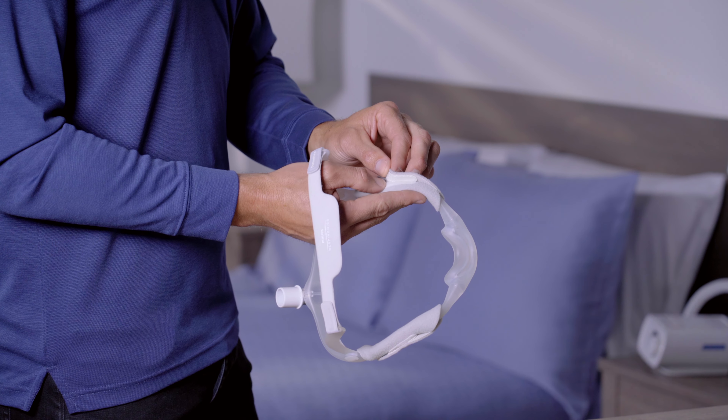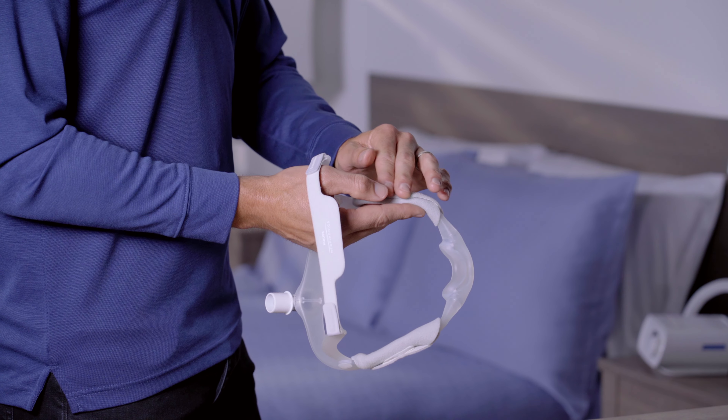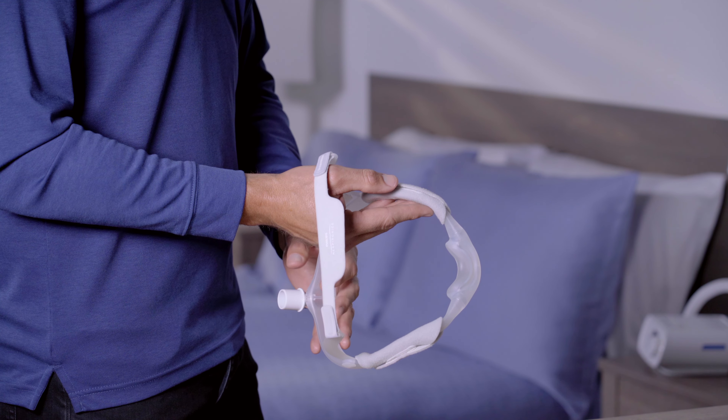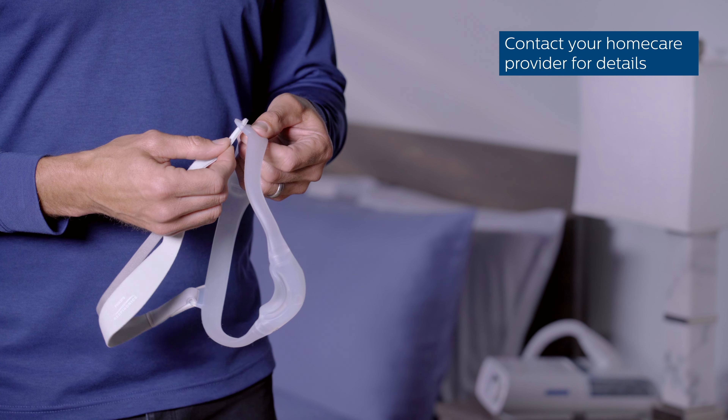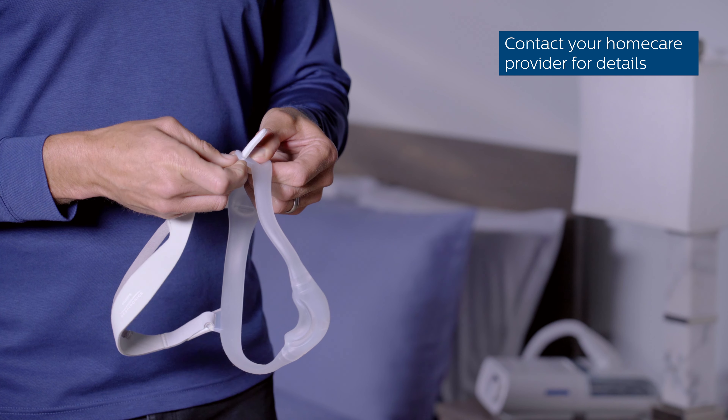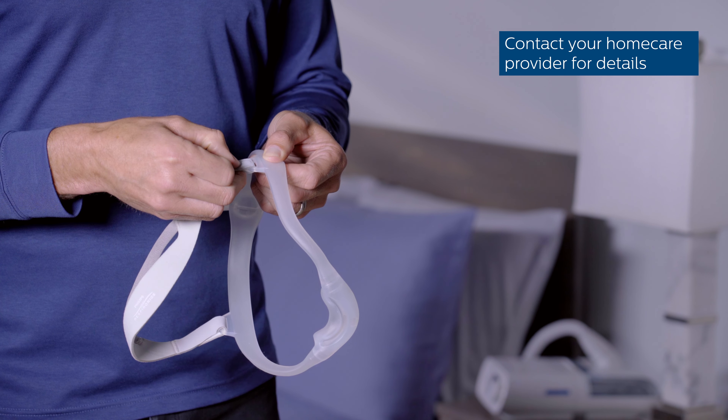As an option, you can add soft fleece wraps around the sides of the frame for added comfort. Position the seams on the outside, away from your face. There is also an optional headgear available for people who prefer one made entirely of fabric.